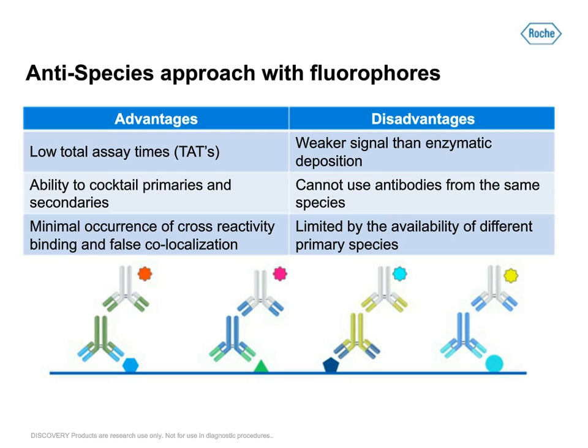But when you are using enzymatic deposition of fluorophores, you will have to detect in sequence. It's just the nature of the beast. And the benefit of this is the fact that you can work with 4 rabbit monoclonals if you want to and detect them all in sequence. But you will have to elute the antibody that you just detected in between each round of detection.